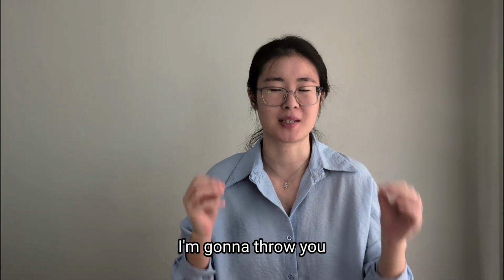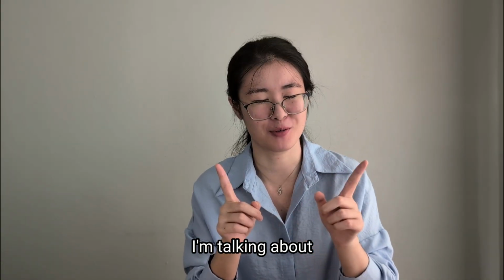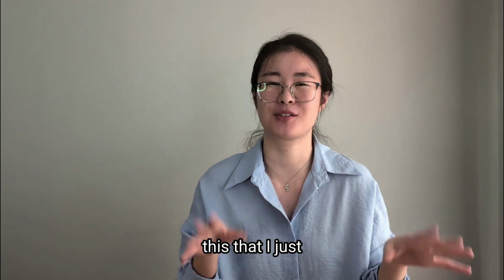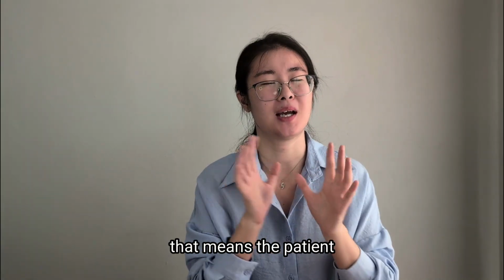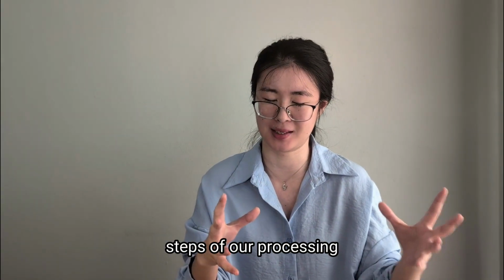I'm going to throw you some jargon: cold agglutinin, warm agglutinin, autoantibody, rouleaux. Do you know what I'm talking about? No? It doesn't matter. You don't have to understand it. All you need to understand is that when any of these exist in a patient's blood, the patient's blood will clump on itself at some steps of our processing.